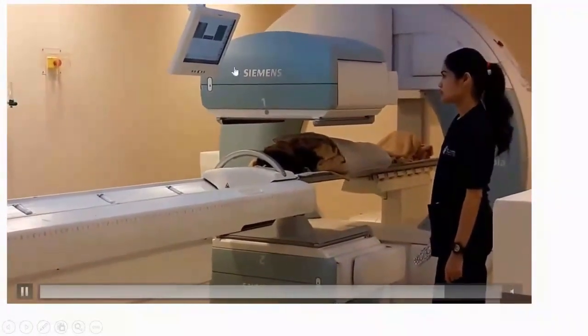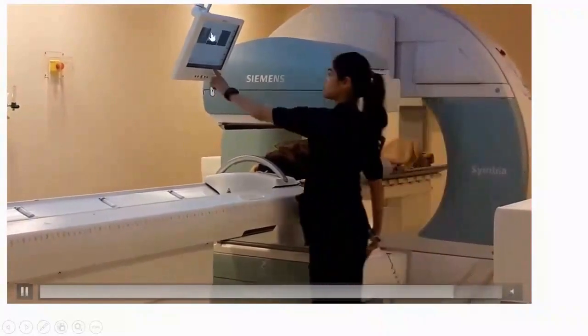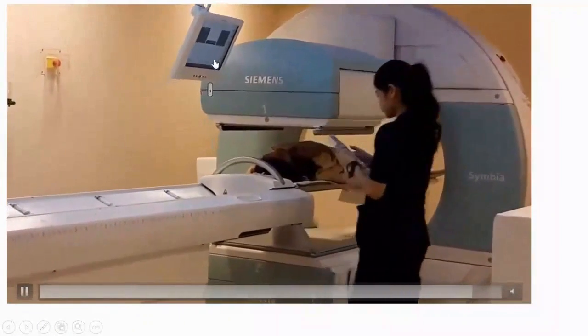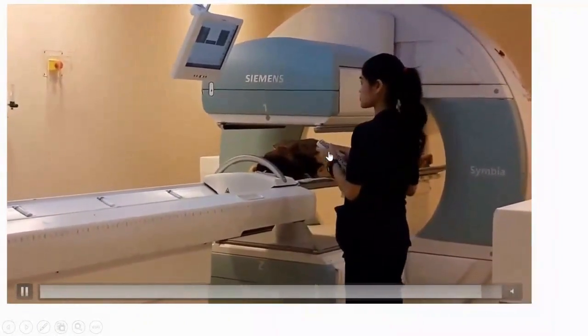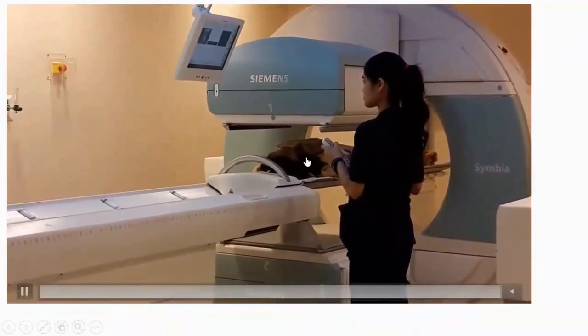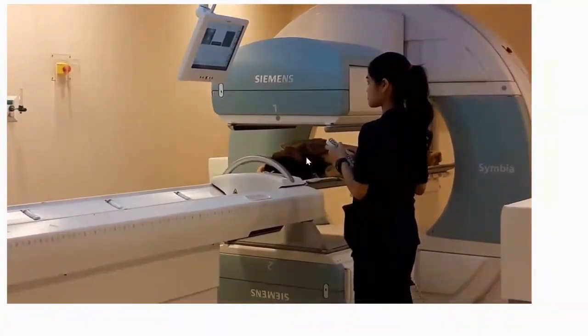We do not need a multidimensional image as it operates one of the detectors. This monitor displays the image in this way and plays it, taking a picture of the thyroid, for example. It starts counting counts, and you can adjust your counts based on the type of isotope you are working with and the matrix you are using. The most common matrix, for example, is the 128x128 matrix size, especially in cases of planar imaging or static imaging.